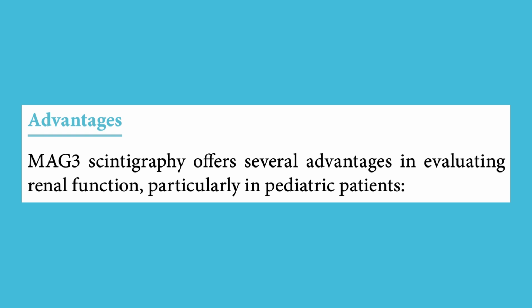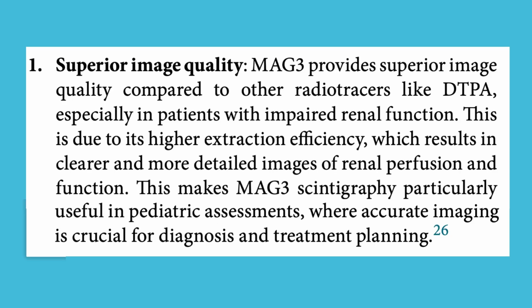Advantages. MAG3 scintigraphy offers several advantages in evaluating renal function, particularly in pediatric patients. 1. Superior image quality. MAG3 provides superior image quality compared to other radiotracers like DTPA, especially in patients with impaired renal function. This is due to its higher extraction efficiency, which results in clearer and more detailed images of renal perfusion and function. This makes MAG3 scintigraphy particularly useful in pediatric assessments, where accurate imaging is crucial for diagnosis and treatment planning.